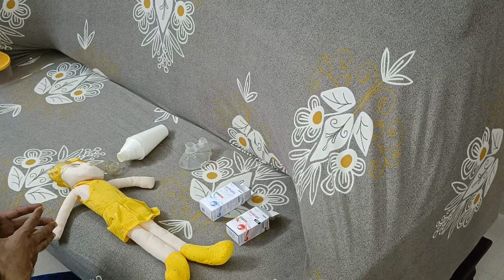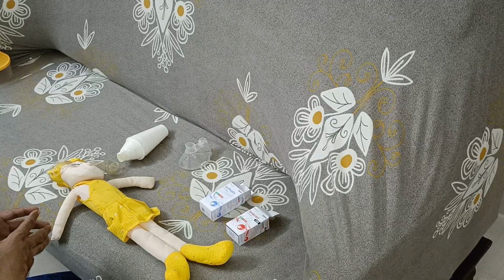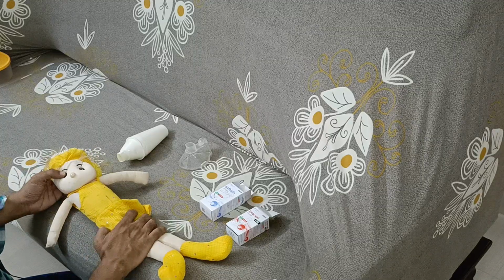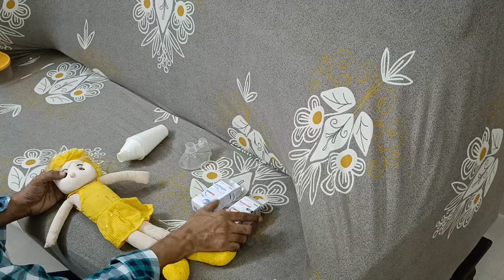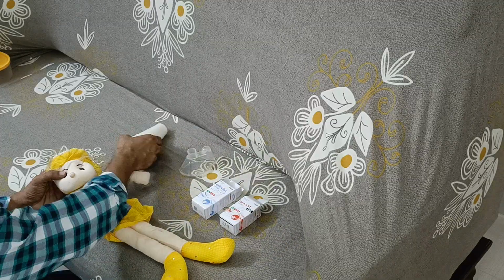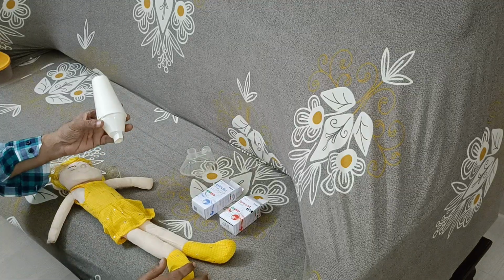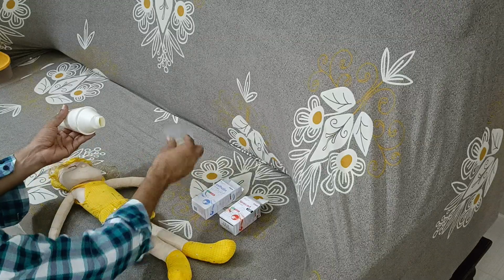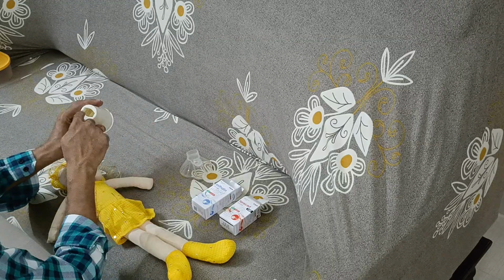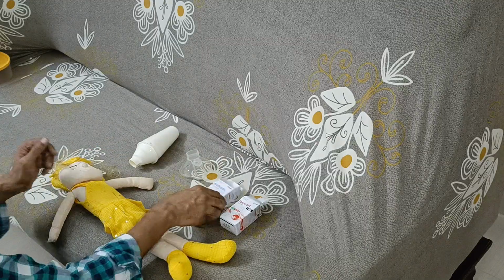Okay, now I'm going to talk to you about the pediatric inhalation. So how you are going to manage pediatric inhalation is basically, I have a mannequin over here, and I have two pediatric inhaled medicines here, something like this one, and there is a mask here, and there is a spacer here. Okay, so this is the spacer, and this is the part that goes to the mouthpiece, and this is the part where you are going to attach the canister. And this is the inhalation.